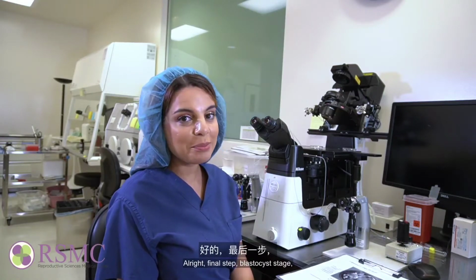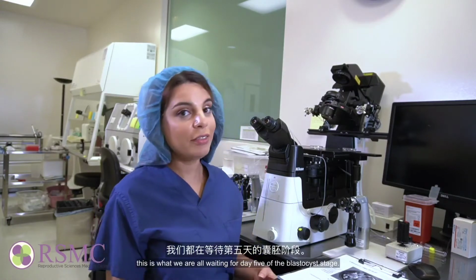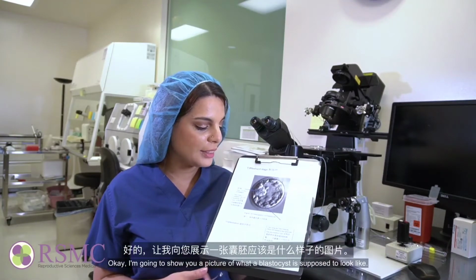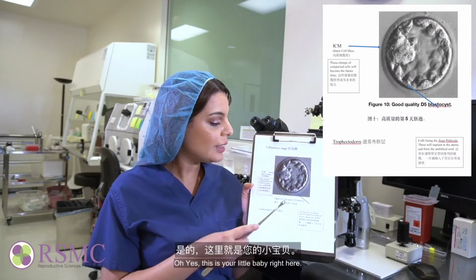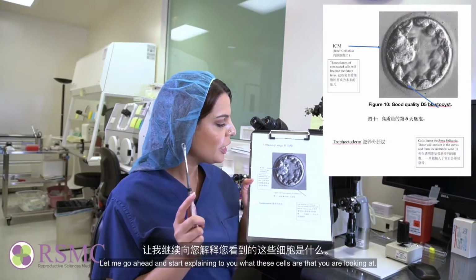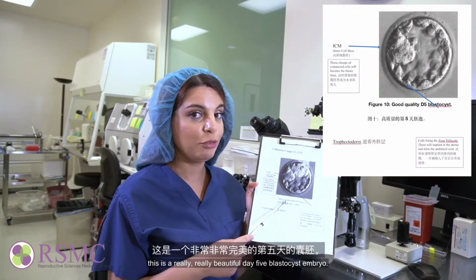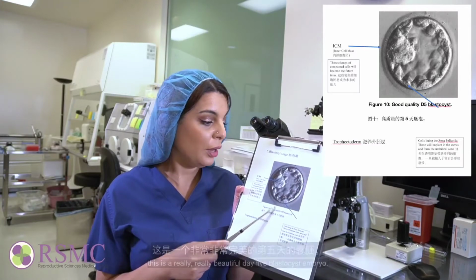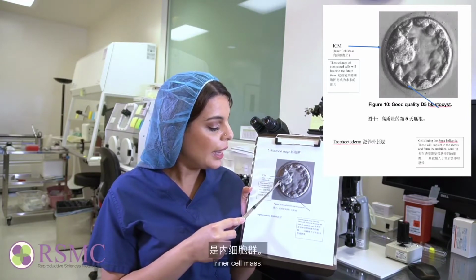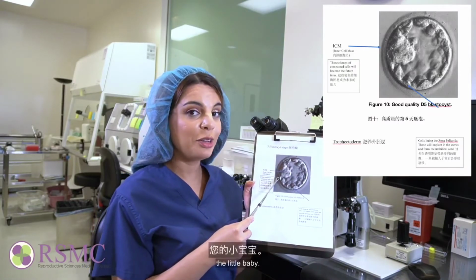Alright, final step, blastocyst stage. This is what we are all waiting for. Day 5 blastocyst stage. Okay, I'm going to show you a picture of what a blastocyst is supposed to look like. Oh yes, this is your little baby right here. Let me go ahead and start explaining to you what these cells are that you're looking at. By the way, this is a really, really beautiful day 5 blastocyst embryo. This part right over here is your ICM, inner cell mass. This is what's going to become the fetus, the little baby.